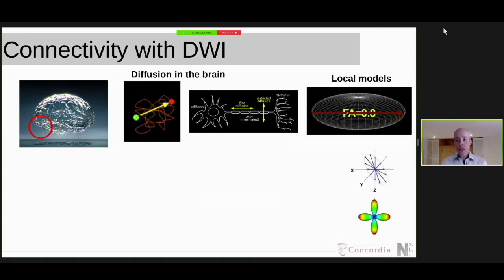So the most famous being, of course, the diffusion tensor imaging model. And DTI gives us things like fractional anisotropy, which I'm sure you've heard of and probably have used or may use. So that's the simplest model really to work with in diffusion imaging. There are other models such as constrained spherical deconvolution, which we're using exclusively. And that's, I think, all of the studies that I'm presenting here. Almost all, yes, all of the studies are using constrained spherical deconvolution, which gives you a better distinguishability between angles of fibers that are crossing, for instance.